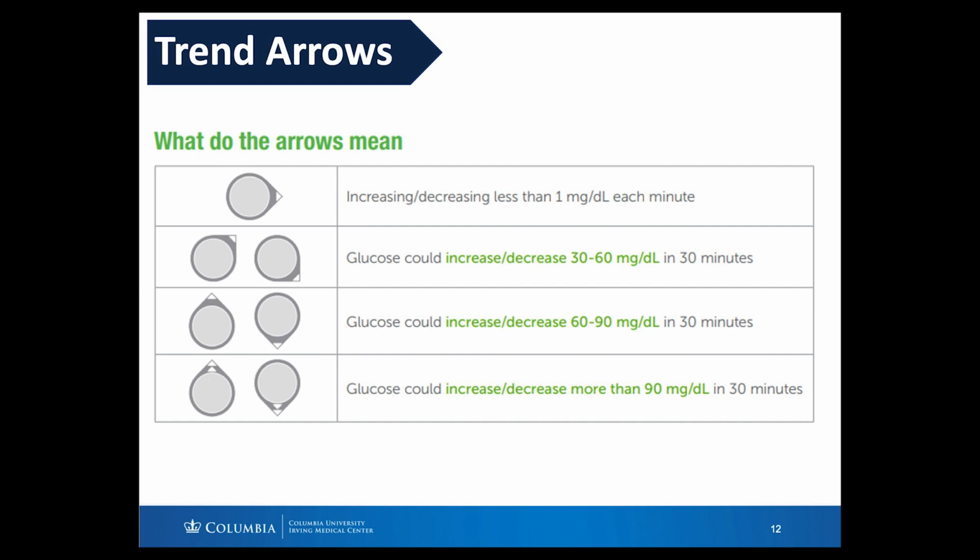So you get to see a lot of these different data that come to be, that, hey, if I'm going low, maybe I can eat a snack. If I'm going high, maybe I need to go for a walk. But again, how do you maybe cheat this system?